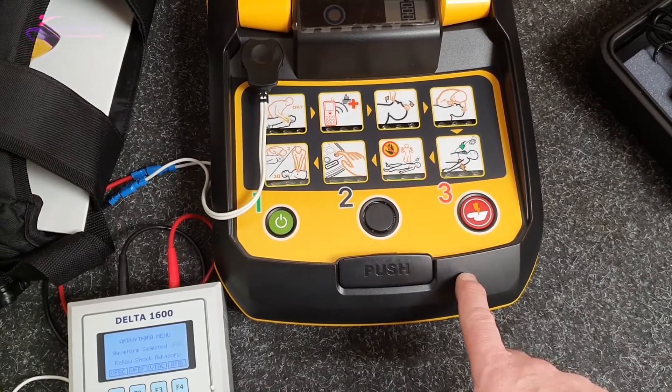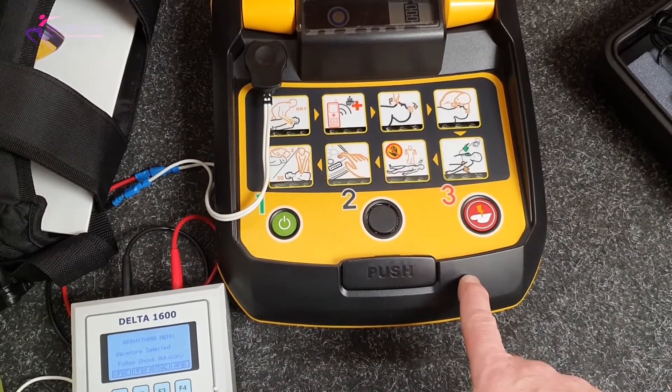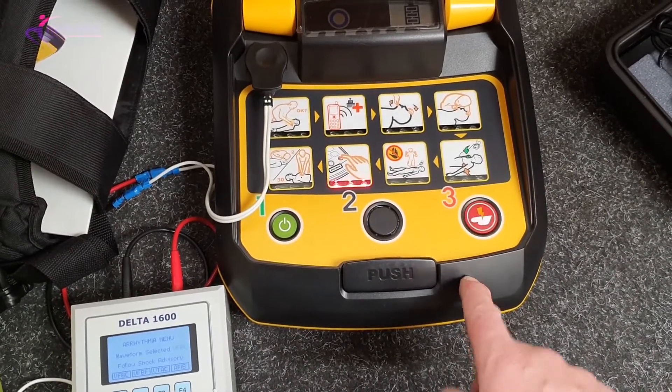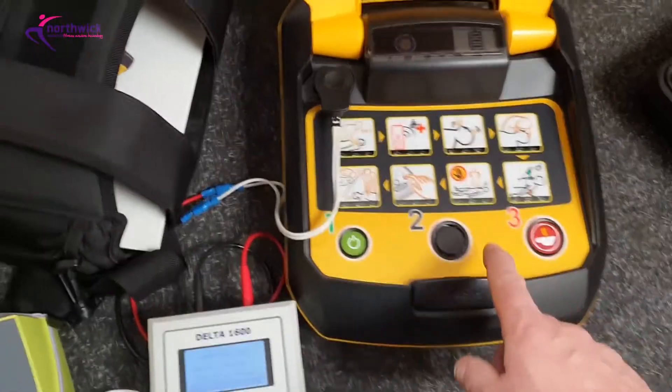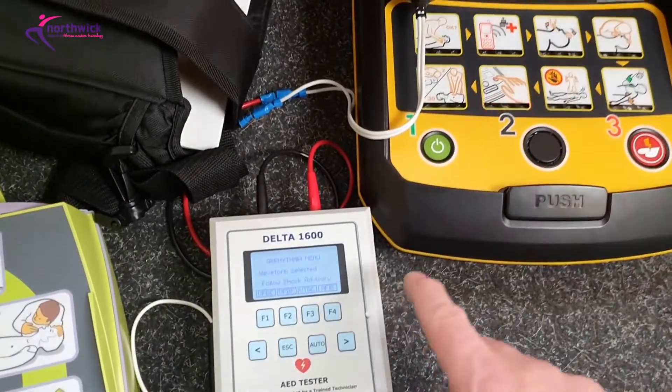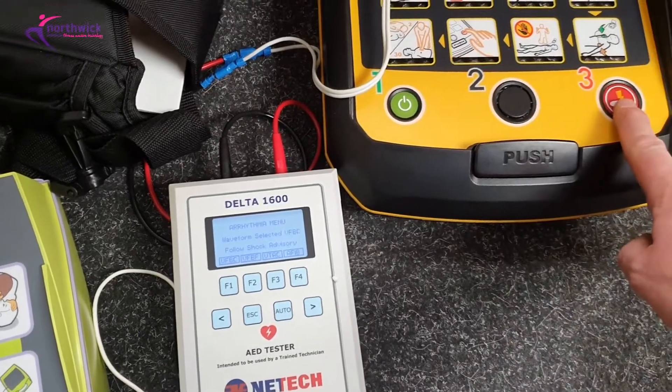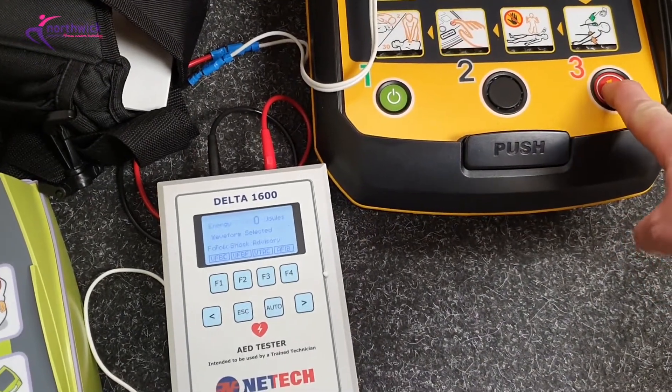Just waiting for it to charge. Press the red flashing button now — deliver shock now. Okay, so the red light is now flashing, it's ready to discharge, and the energy delivered should appear here when I press the red button.